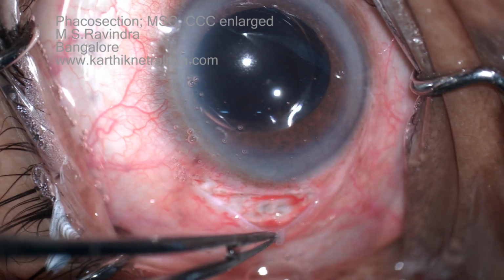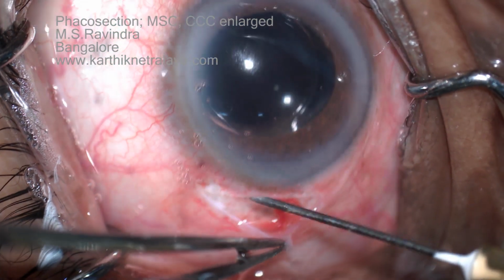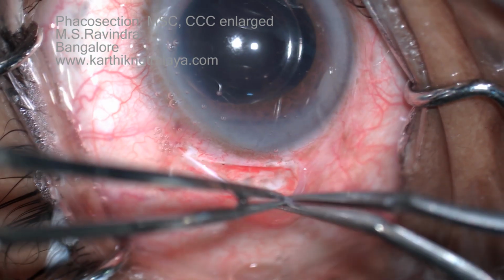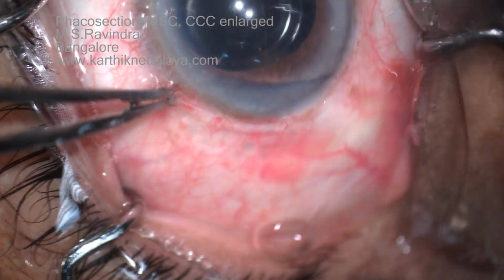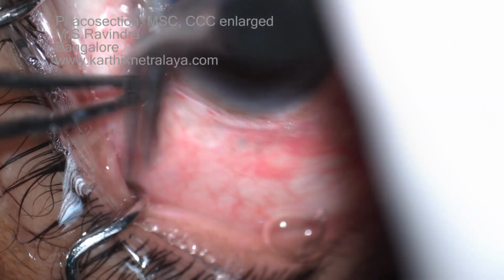The only one limbal incision of the conjunctiva is closed with the components of fibrin glue. So there is no external opening at all at the end of surgery. The eye is kept open. It's done under topical anesthesia.